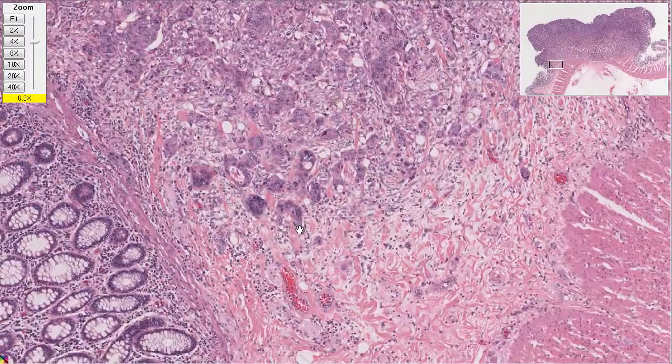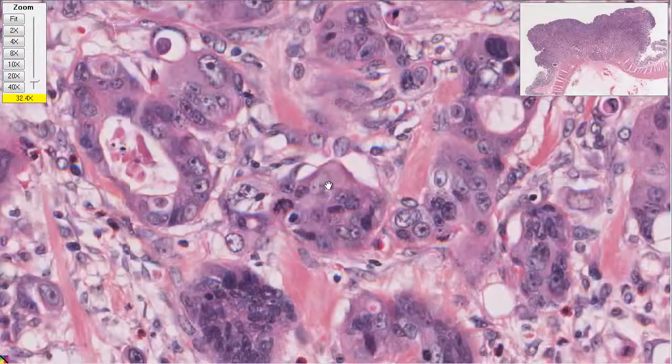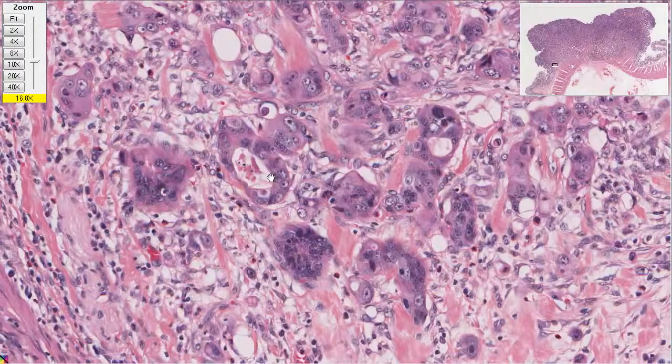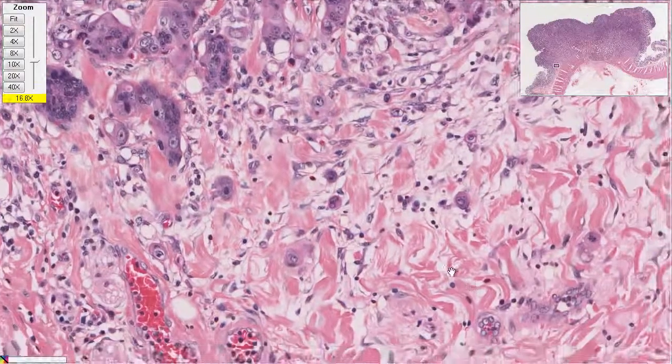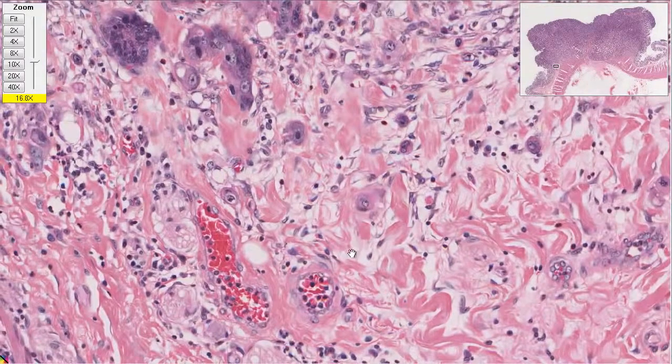Right. And what's interesting about this is that when you look at something like this, there's such a thing called, for cancer, grade. What grade is basically what we've been just talking about. How bad does that look? And so the grade is, wow, that looks nasty. Is nasty a technical term? Actually, we use it quite a bit. People say, well, with that tumor, we said it was nasty. When we talk about nastiness, it's a lack of good behavior.